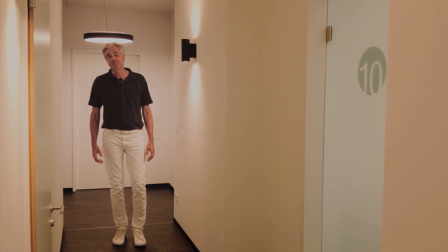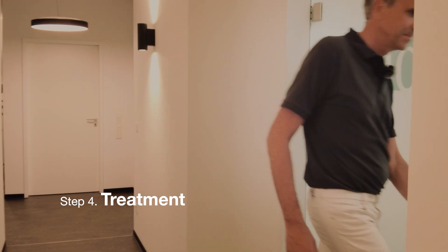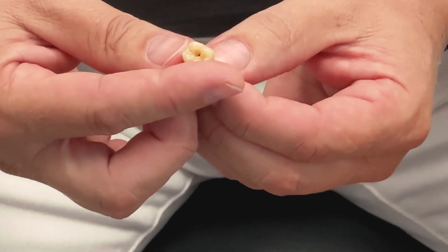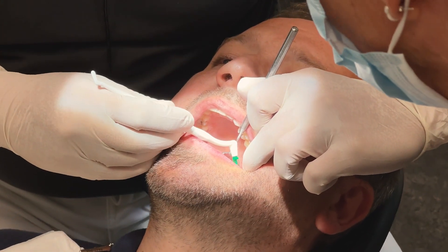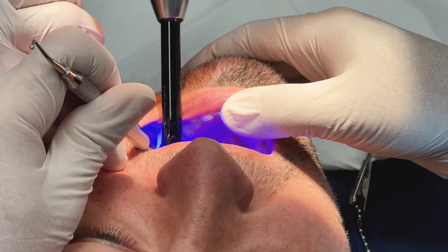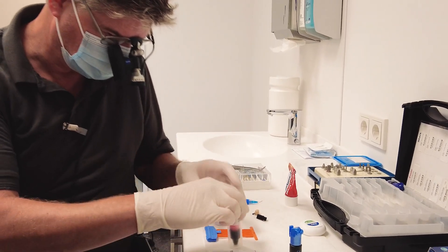The denture is made. The second treatment step is the insertion of the restoration. After a short waiting time for the patient, the final crowns are inserted. In this particular case, we adhesively cement the crown on the natural tooth and screw-retain the crown on the implant. The prosthetic treatment is complete. Thanks to our digital process chain, we have achieved an exact fit and placed two excellent crowns for our patient.